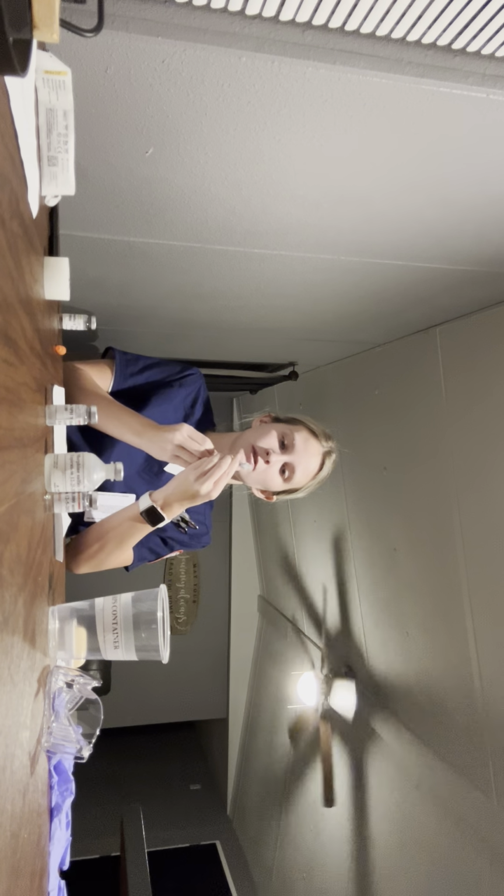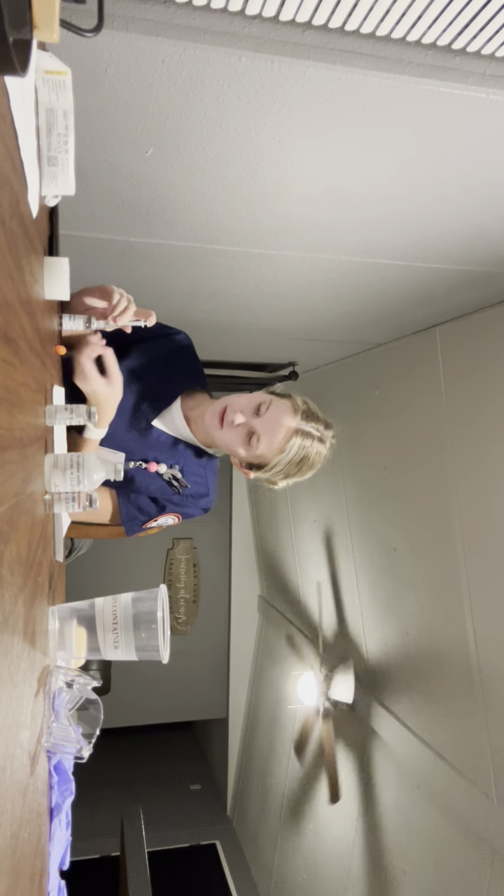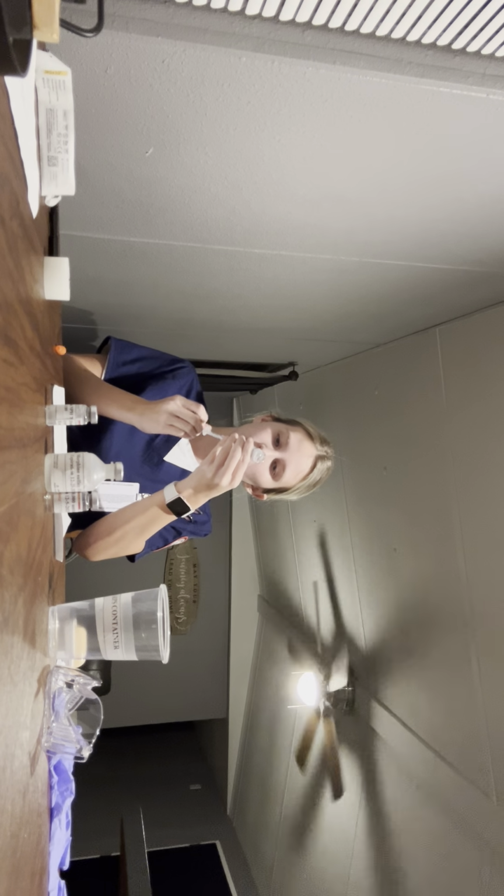So I will grab an alcohol pad and go from inside to out to avoid contamination. And then I will grab my syringe, and I will put 10 units of air. Yep, 10 units of air. Now I'll put that into my vial, and then put 10 units of insulin into my vial.